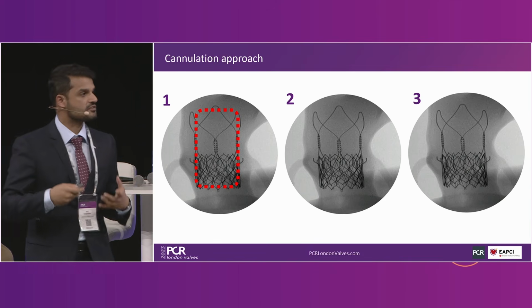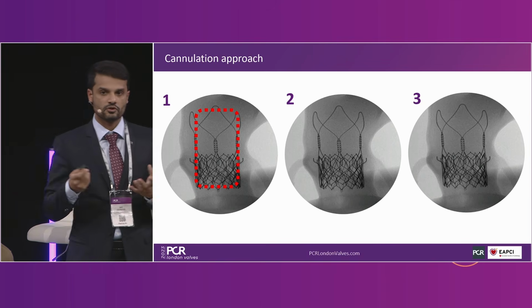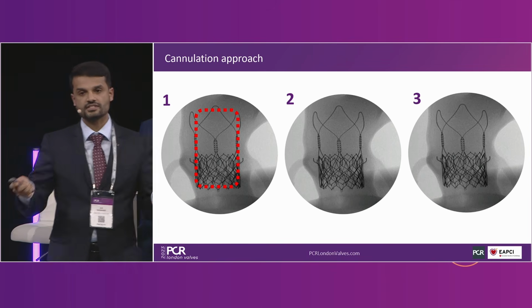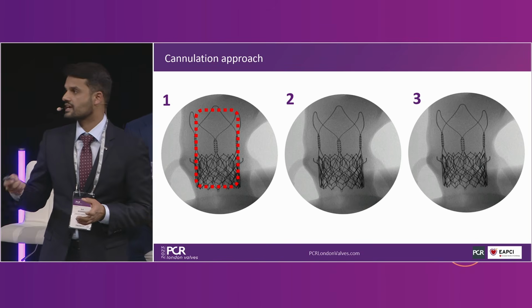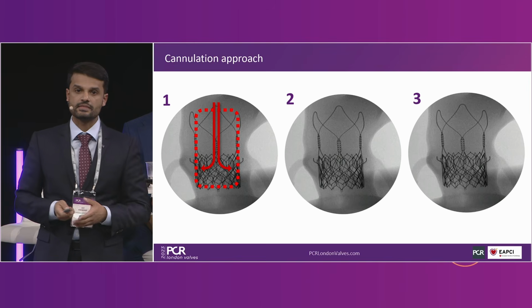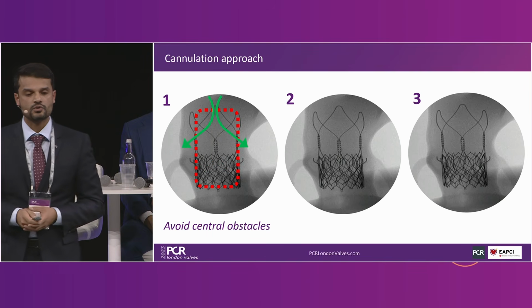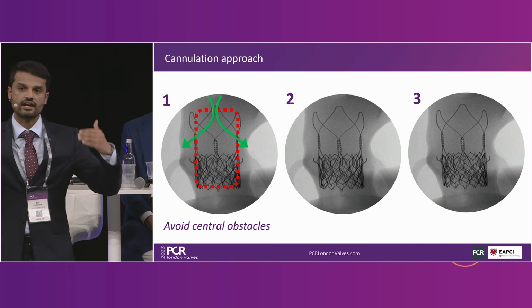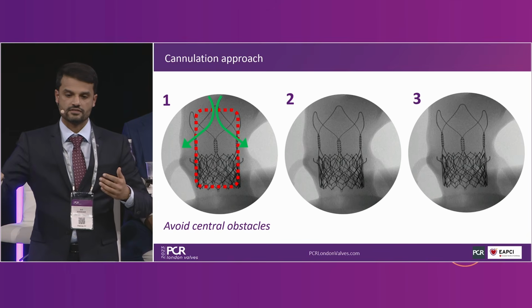If we were to take a conventional cannulation approach, like we've all been taught, of bringing the catheters down through the middle and rotating to the sides, we'd be much more likely to engage all the obstacles and all the problems that we have. So instead of coming down through the middle, particularly with this valve frame, what we want to do is deflect our catheters to the sides earlier and higher up, inner curve, outer curve.